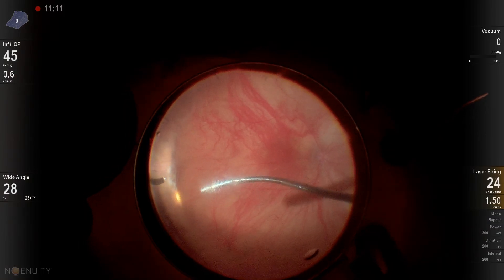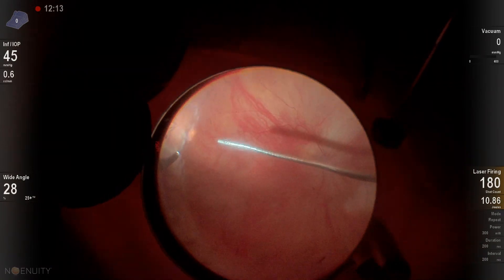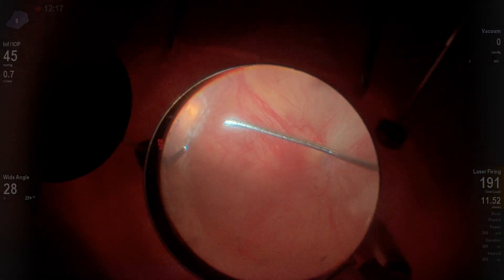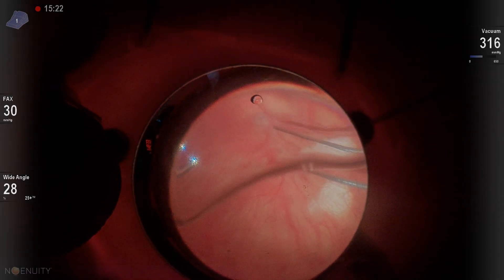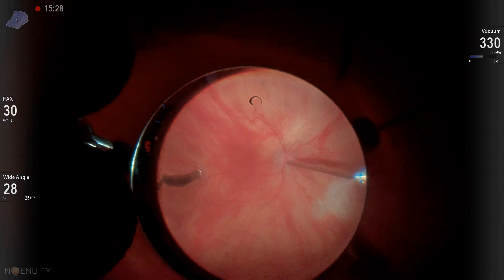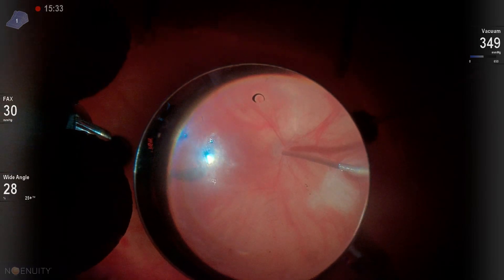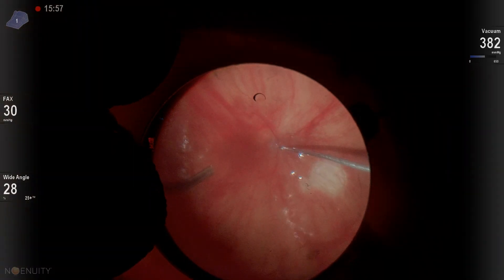In this case, we want to go ahead and reinforce things by adding some additional laser. So we're going to laser on our buckle in areas that we have potential concerns about, but nothing that's going to require this patient to have oil back in their eye. And then last but not least, I always do like to perform an air-fluid exchange in a patient like this, so we can remove all the residual oil bubbles and anything that might be trapped in this patient's eye so that they don't have untoward floaters afterwards.